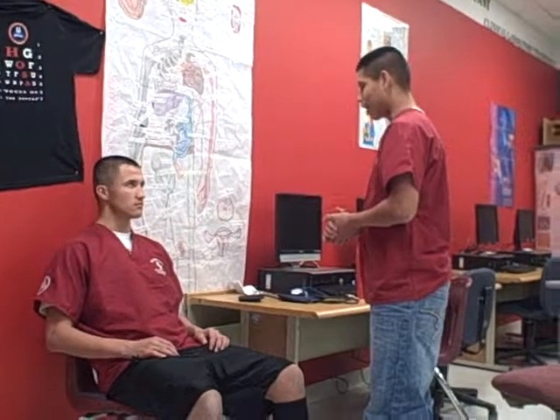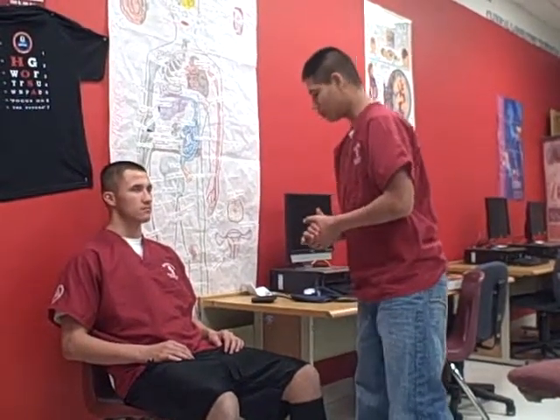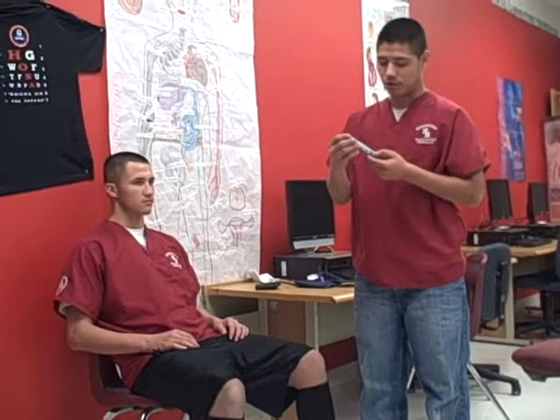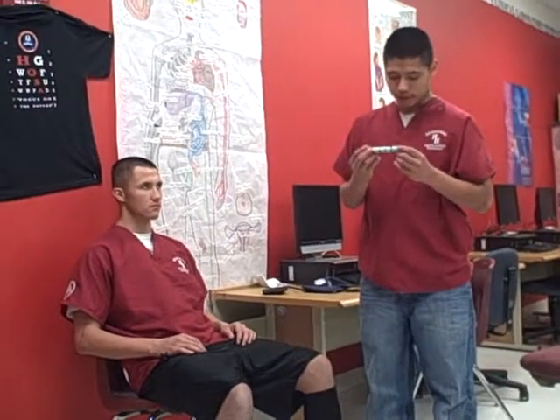Do you have any allergies or any medication? No. I will select the proper medication and I will check it — it is 0.3 milligrams of epinephrine, adult dosage, and the expiration date is 2-12-2010.